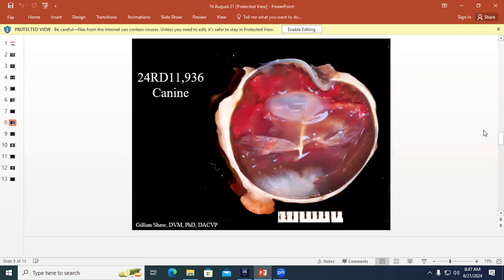What do you think, Gasper? Yeah, it doesn't look like a porcupine quill. Yeah, histologically, it looks like plant material. Maybe this is a thorn or something like that. We said we didn't really see the barbs on the outside of it that we often see with grass awns. Cactus quill? We talk about a cactus. You have a cross section of it.